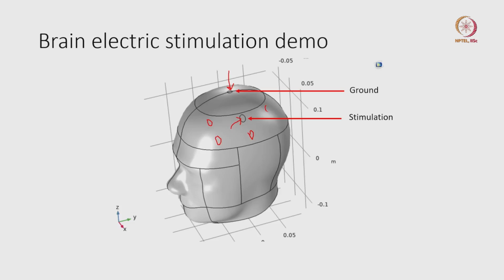In an actual example or prototype, there is not just a single stimulation, but an arrangement of various positions of the stimulation. But in our example, we are going to start simple. So we are only going to use this as a stimulation area and this as a ground region. Let us see how you can do that in COMSOL.